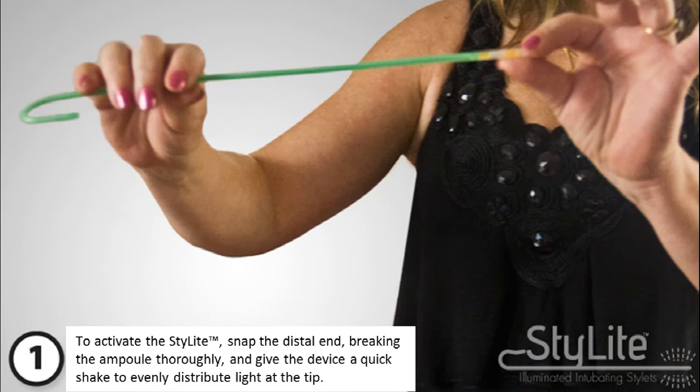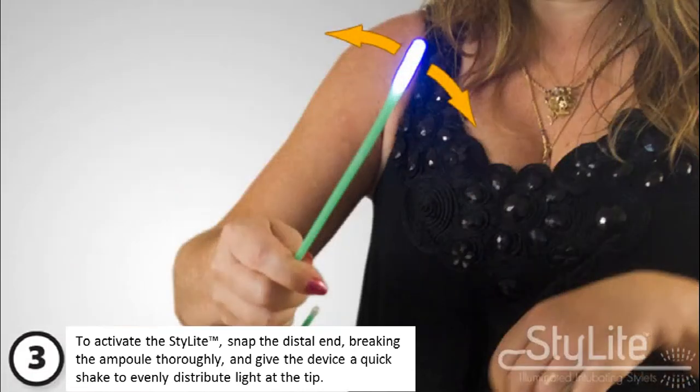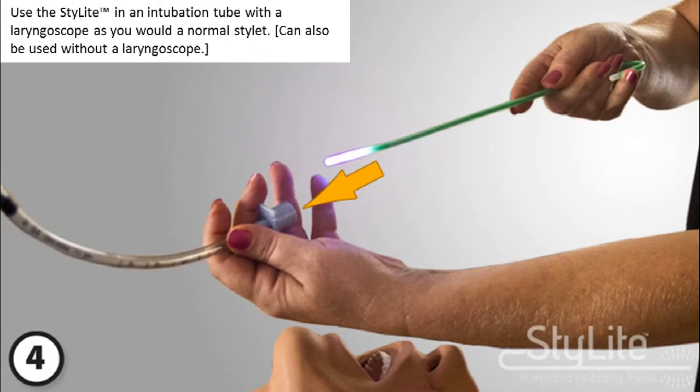To activate the stylet, remove it from its packaging and remove and discard the black protective cap. Then snap the distal end, breaking the ampule thoroughly, and give the device a quick shake to evenly distribute light at the tip.